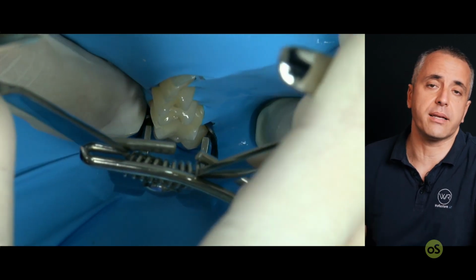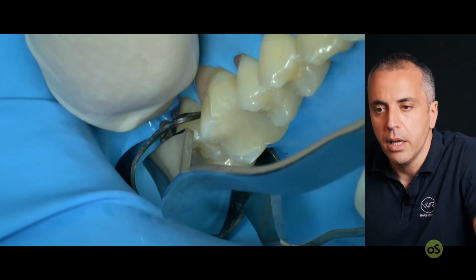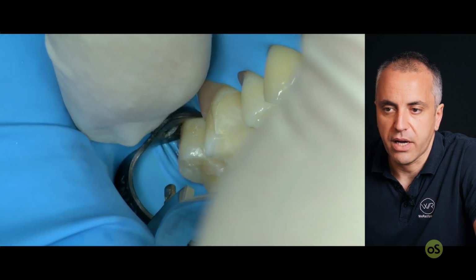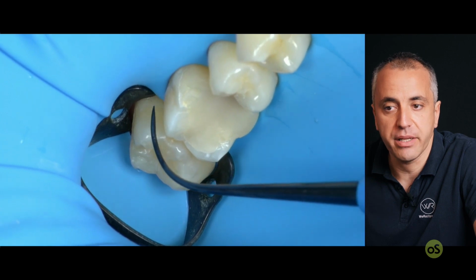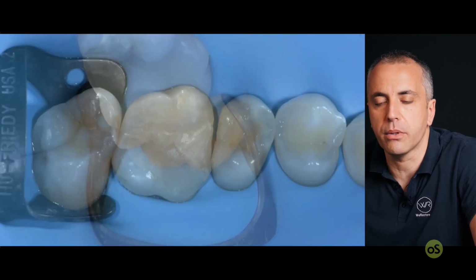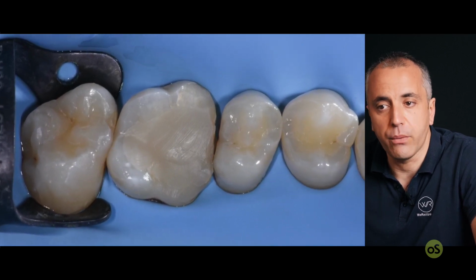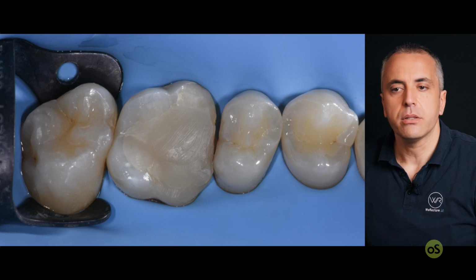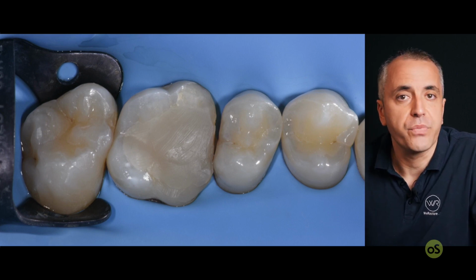I chose the wingless clamp, not because it's wingless, but because I liked more the shape that it had around the tooth, and slowly and gently adapting around the tooth. Now we have a better adaptation, more predictable, and nothing from the oral fluids will come inside our operatory field. So let's start and prepare the overlay of the molar.